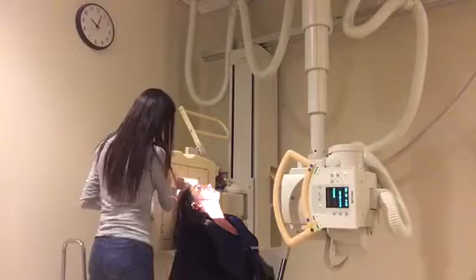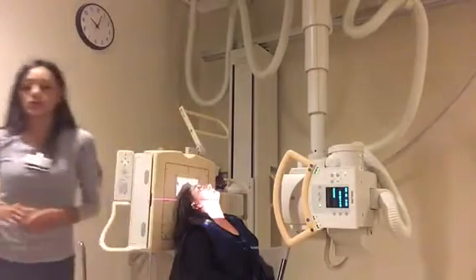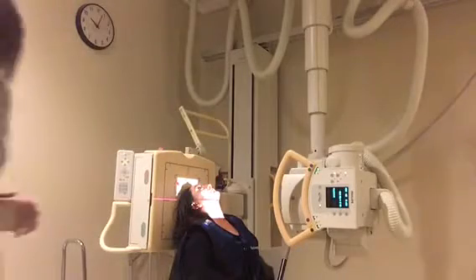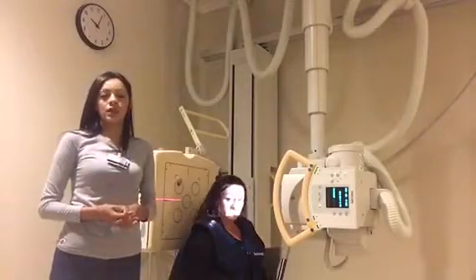Patient's right side. Okay, let's go ahead and hold still. So go ahead, take a deep breath in, hold your breath, and x-ray. Okay, you can go ahead and relax. So that concludes my projections for the sinus.